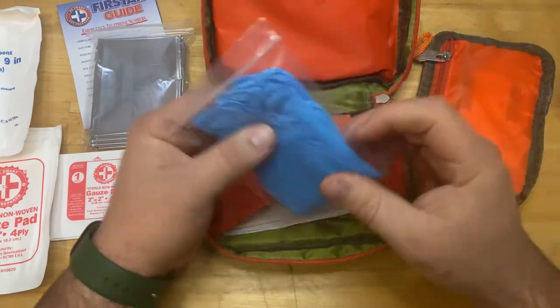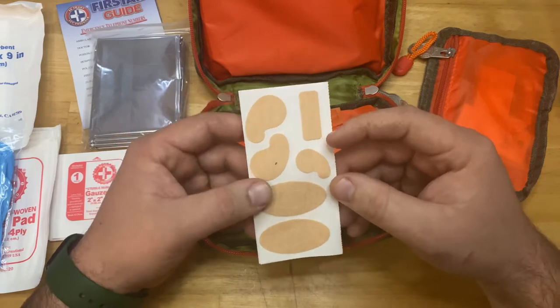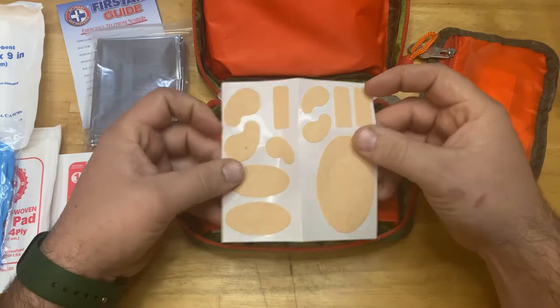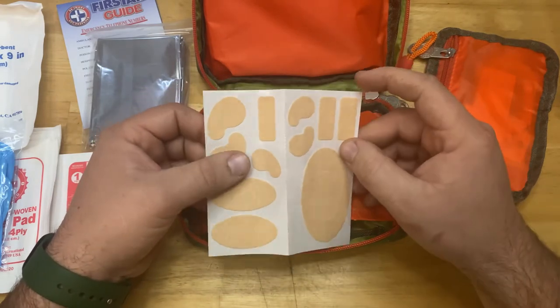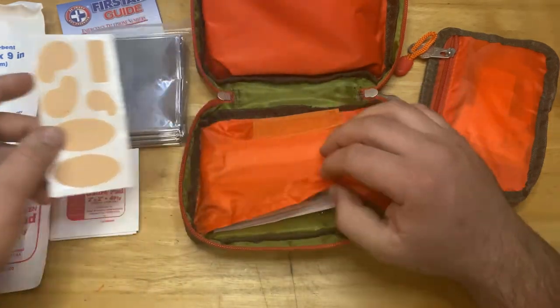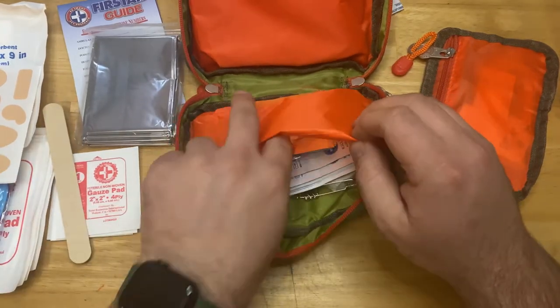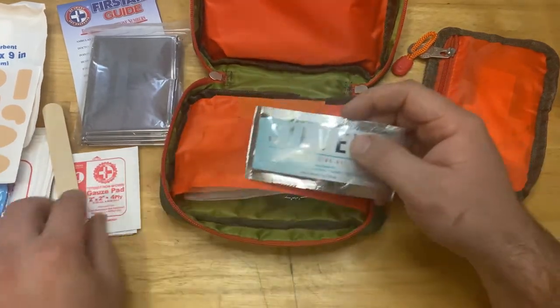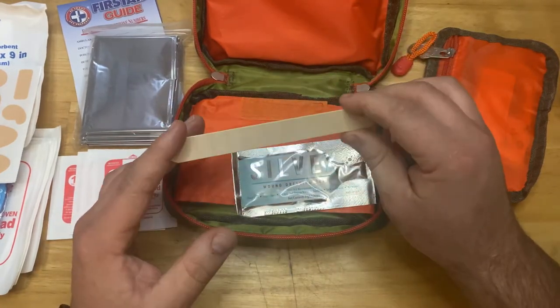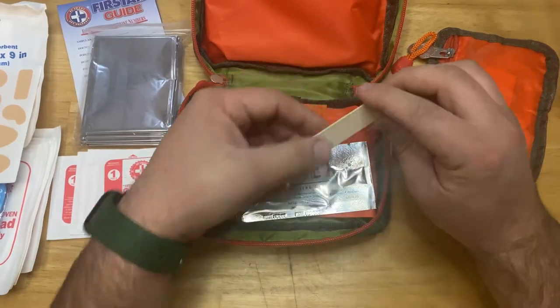In the back of the kit we've got gloves and some moleskin in different sizes. Moleskin is great for blisters — especially on heels and hands. If you're going out with kids and they start getting blisters, throw this on and it'll definitely help them out. There's also a popsicle stick you can use for splinting extremities — small fingers, phalanges, anything like that. You might get away using it on a wrist, but something's better than nothing.